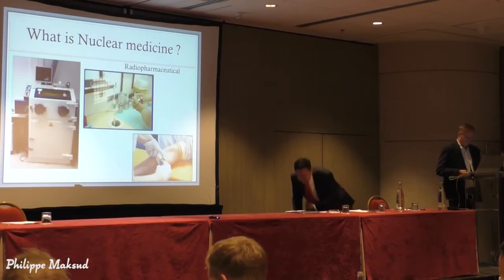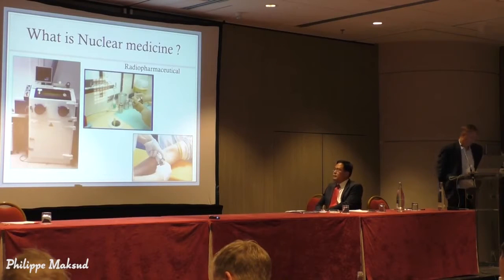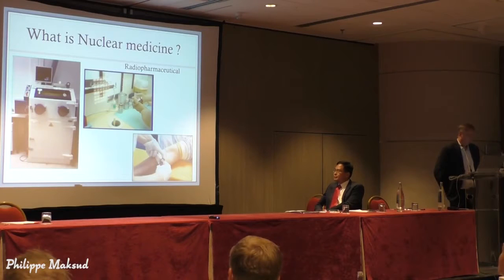What is nuclear medicine? The radiopharmaceutical, FDG, fluorodeoxyglucose, is injected after 1 hour of rest, and the examination is performed by scanner, including the PET and CT. The duration is about 15 minutes, and the patient has to be fasting.